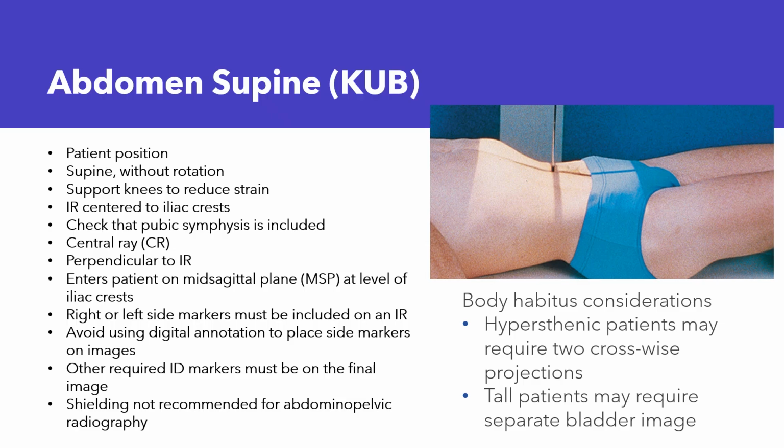And so it's typically not possible to shield reproductive organs and not clip the anatomy when you place the shield. Okay, it can be done for a male, but you have to be very, very specific with your shield placement. Sorry, got interrupted again. All right. I think I got through.